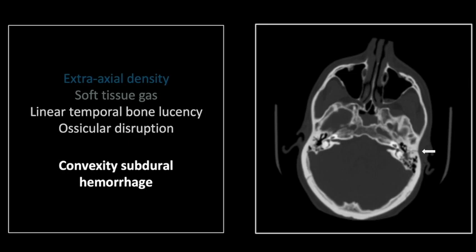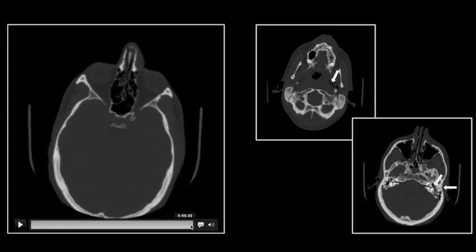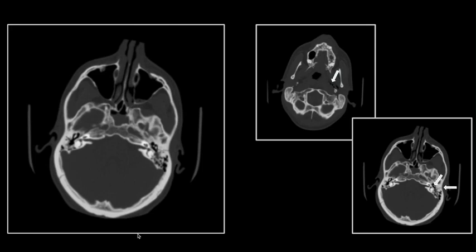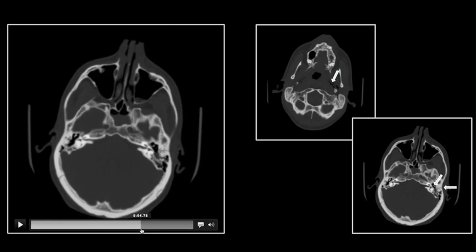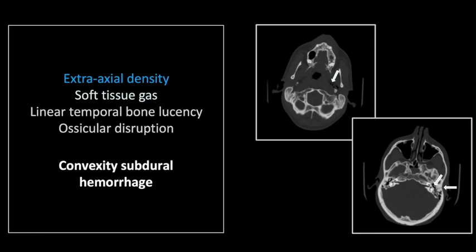These longitudinal fractures are particularly associated with ossicular disruption. Compare the ossicles to the opposite side — pretty impressive. The malleus and the incus are not aligned as they should be, and this obviously does result in conductive hearing loss. The transverse temporal bone fractures, in contrast, will result in sensorineural loss and disruption of the otic capsule. That soft tissue gas, the linear fracture line, and the dissociation of the ossicles are all present. So that is a convexity subdural hemorrhage with an associated temporal bone fracture and ossicular disruption.